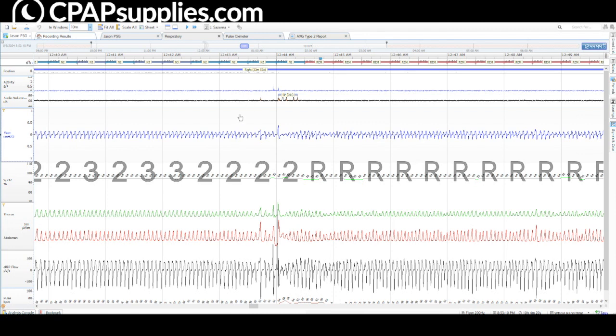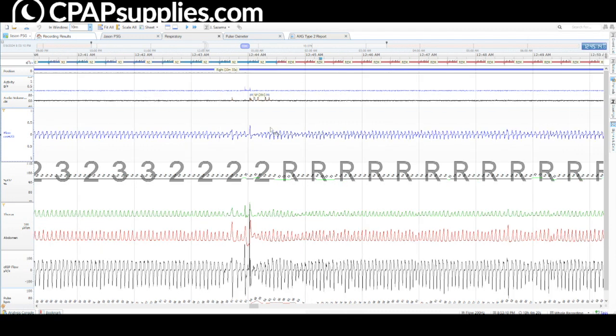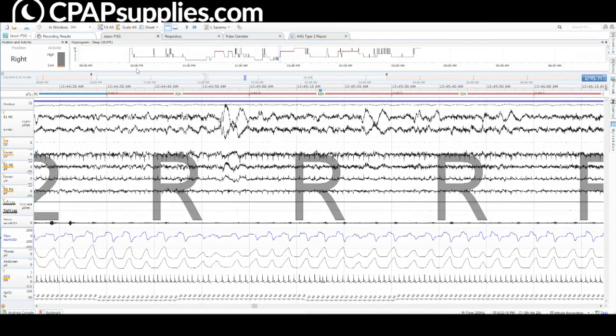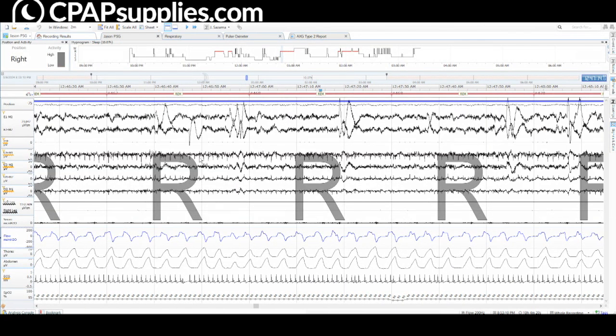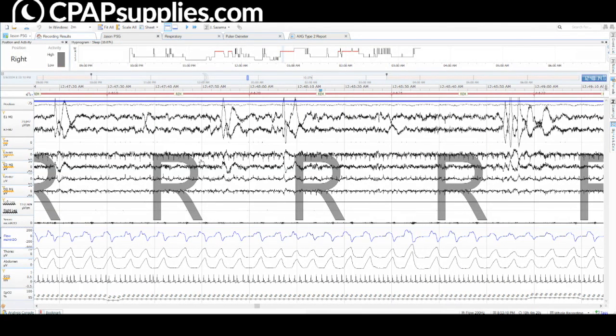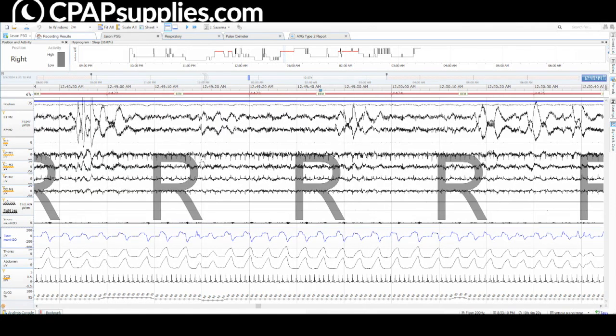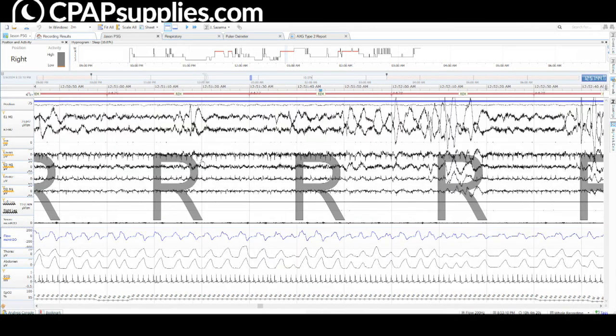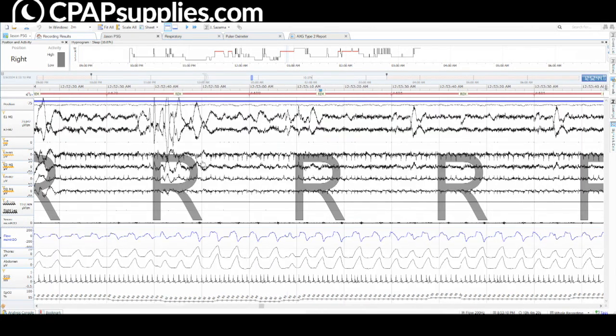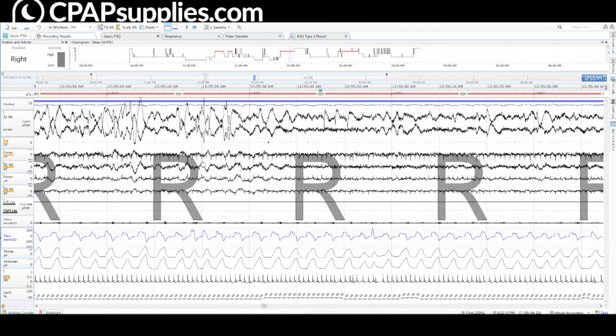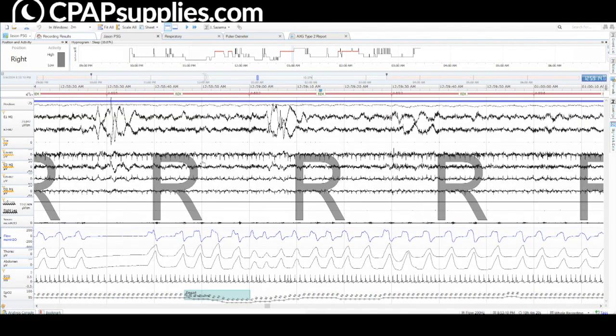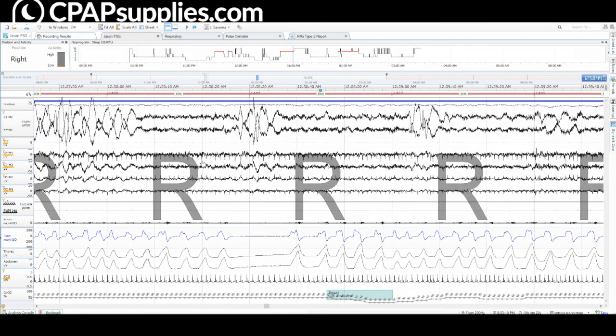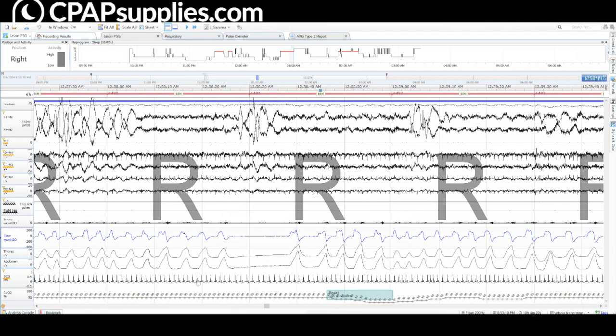Yeah, there's really no reason for it. But this is all REM breathing over here. So let's go back to that and we'll keep progressing. REM, big, massive eye movements, rapid eye movements. Right there, technically, this is a big central apnea. I don't ever really score those in REM because these are natural parts of REM breathing. You'll see these transient central apneas.